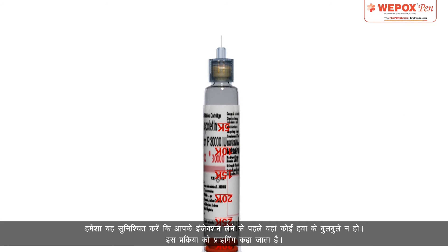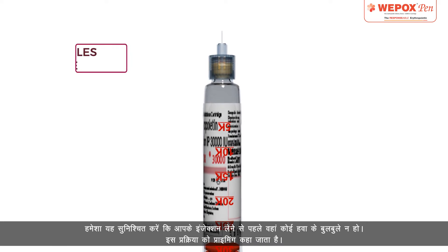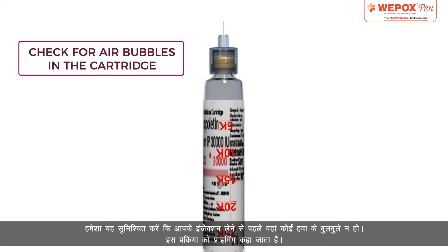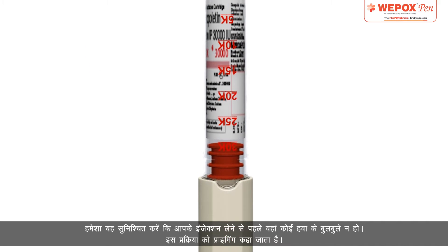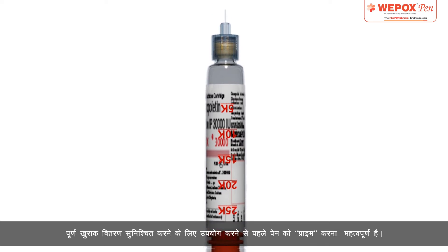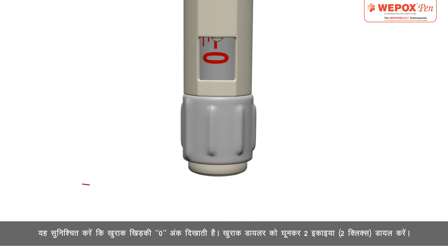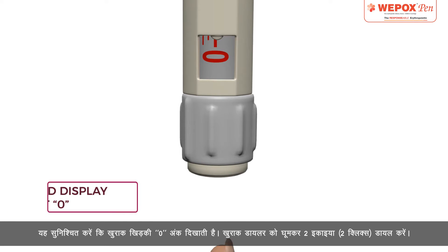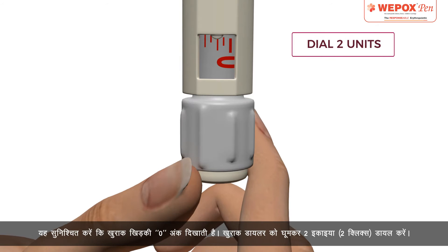Priming: Always ensure that there are no air bubbles before you take your injection. This process is called priming. It is important to prime the pen before use to ensure full dose delivery. Ensure that the dose window displays digit 0. Dial 2 units or 2 clicks by rotating the dose dialer.